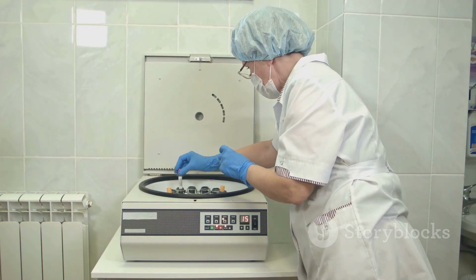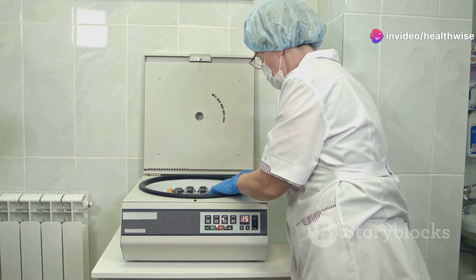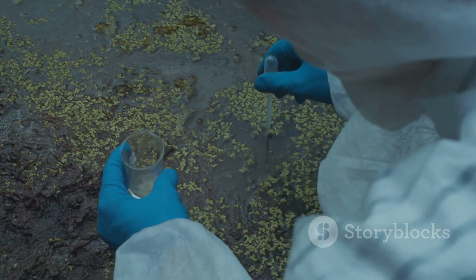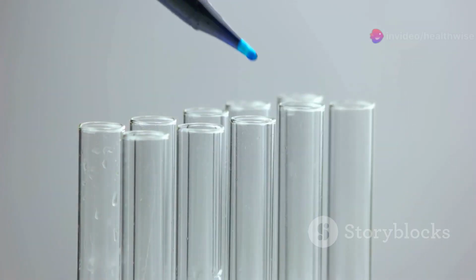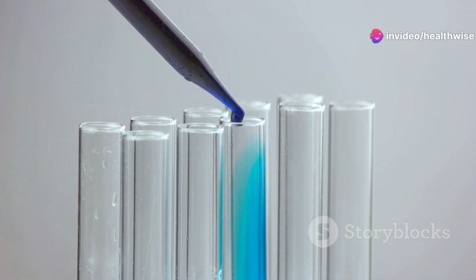3. Fill the tube with tap water, leaving 2 to 3 mm from the top, and centrifuge for 1 minute at 500 xg. 4. Decant the supernatant fluid, refill with water, and resuspend the sediment by stirring. 5. Centrifuge again for 1 minute at 500 xg. 6. Decant the water, add 2 to 3 milliliters of zinc sulfate solution.